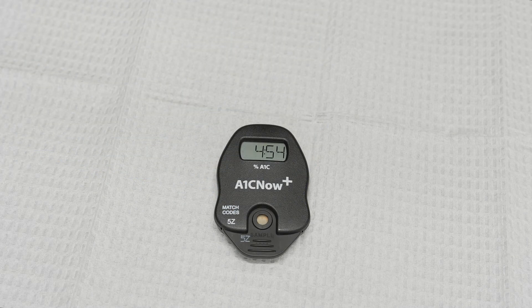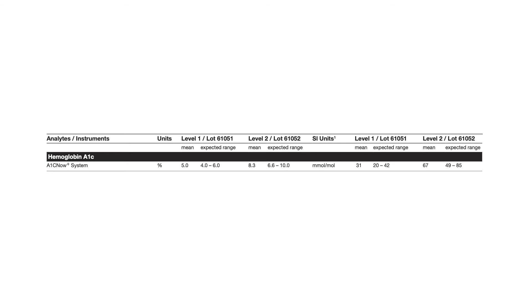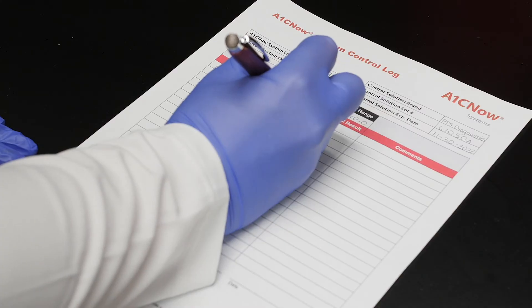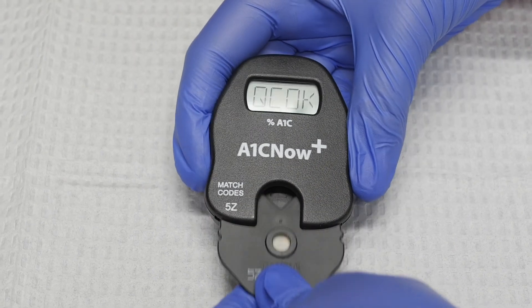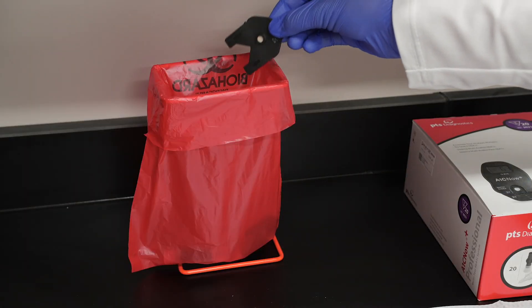The analyzer will display results in five minutes. Once the results appear, check the ranges in the A1C Now Plus Controls instructions for use to see if your results are within the specified range. Record your results and remove the test cartridge from the analyzer. Discard the test cartridge in a biohazard container.